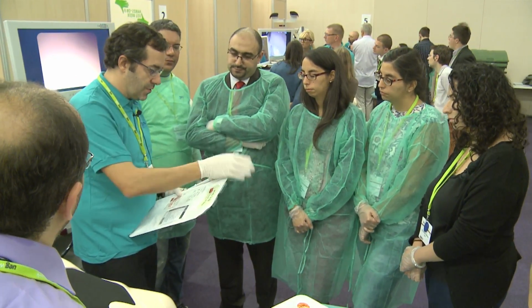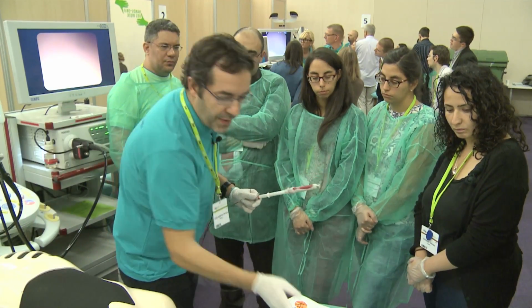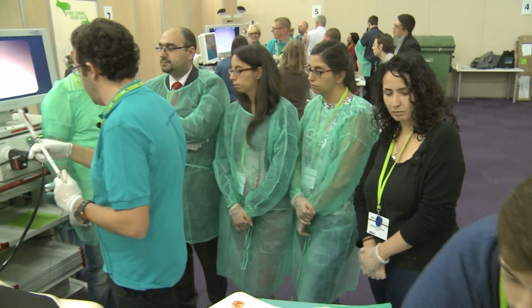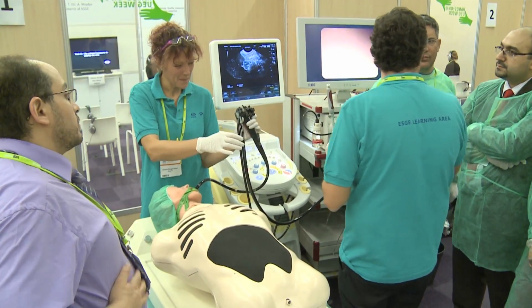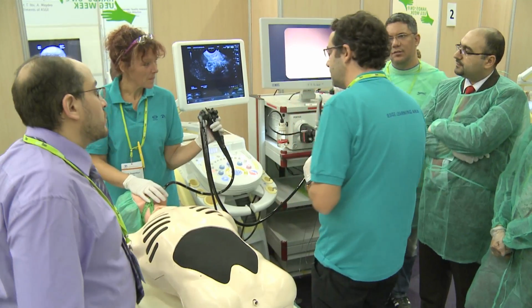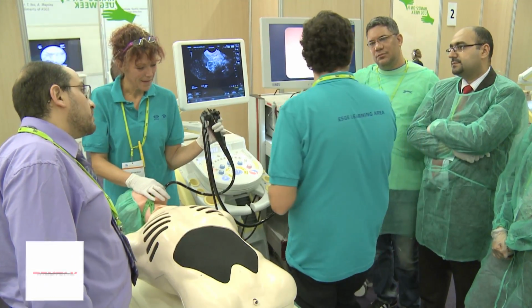Okay? So this is important to prepare the needle to do the puncture. So once we have the needle prepared, and she has already performed the suction, because I always use suction, we can explain about suction and a slow pull technique. We can discuss about that.